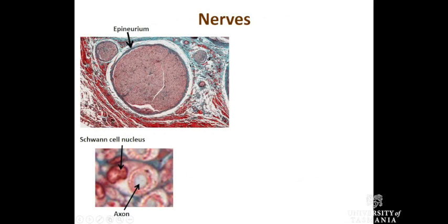So here we've got several nerves in section. This is a trichrome stain section. So here blue is collagen. Out here, and unfortunately the blue is gone to sort of a reddy color. So this outer layer here is the epineurium, so dense irregular connective tissue. It sends in these folds of this perineurium, so surrounding a fascicle. So here's one fascicle, here's probably another fascicle, so this will be dense irregular connective tissue. You can see some blood vessels present here.